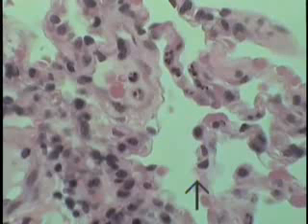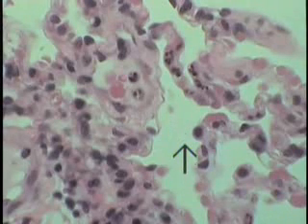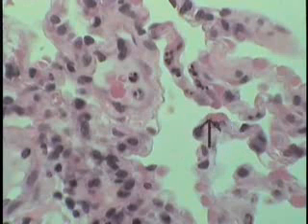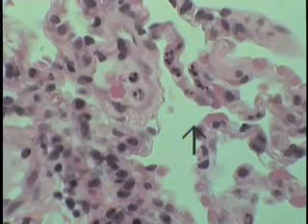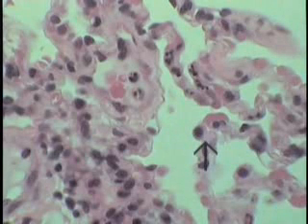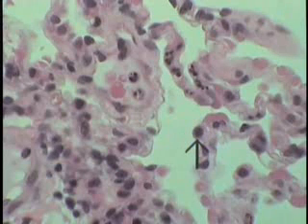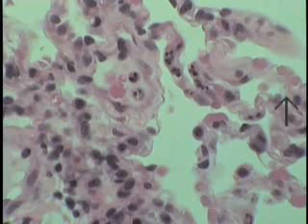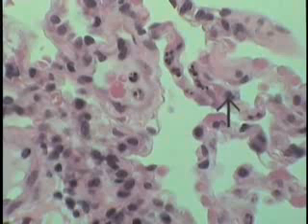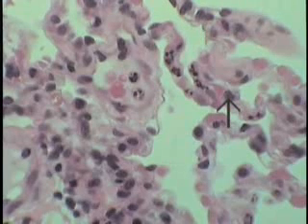Here again, though, it's not very well represented. This is sort of a collapsed alveolus here. Here again are 2 erythrocytes, and then that very thin barrier shown here. This rounded cell, though it isn't well represented here, is a type 2 pneumocyte. They usually have a frothy appearance. They're sometimes countersunk down within the alveolar wall. There's another collapsed alveolus shown here. This is another example here, perhaps better, of a type 2 pneumocyte.